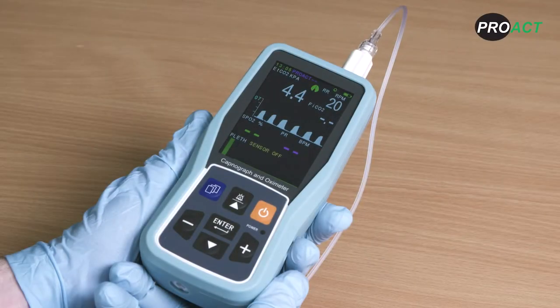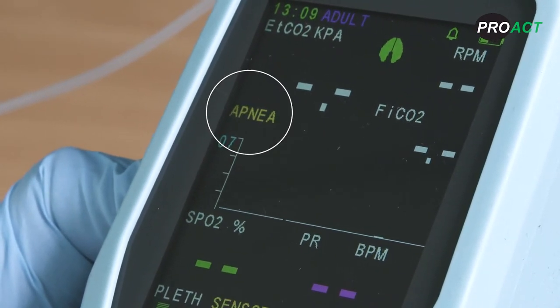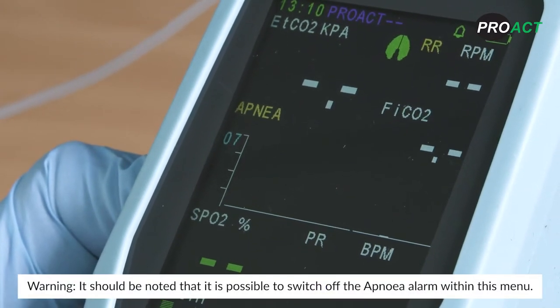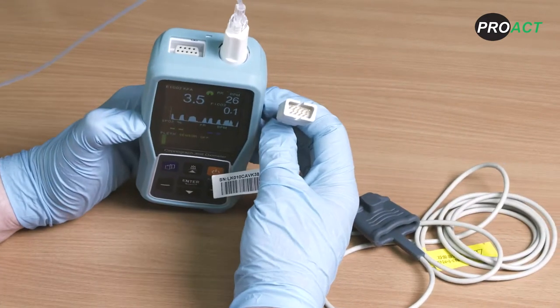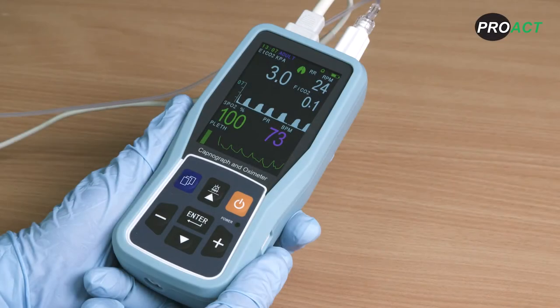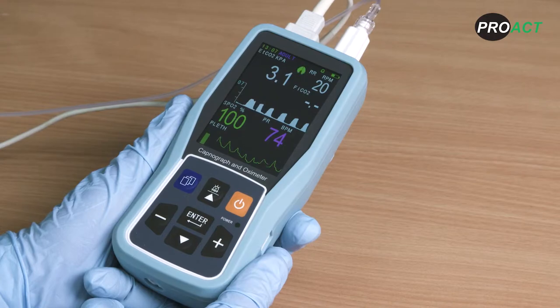Now the sample line and patient are connected, you can see how the capnogram works on screen. If you have a situation of apnoea, the apnoea alarm will trigger. The apnoea alarm delay is user adjustable via the CO2 set menu. It should be noted that it is possible to switch off the apnoea alarm within this menu. Next, connect the pulse oximetry sensor making sure that the arrow is front facing. Once connected you will see the pleth waveform signal amplitude bar and pulse oximetry values on screen, along with the SpO2 percentage and beats per minute.